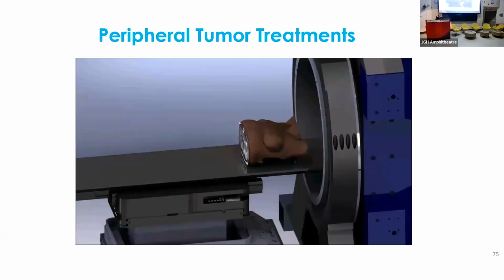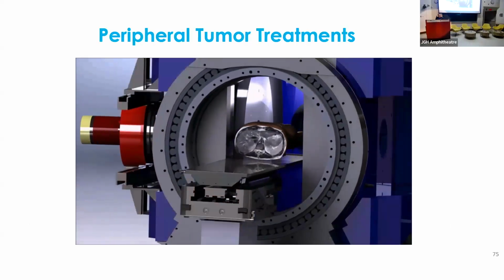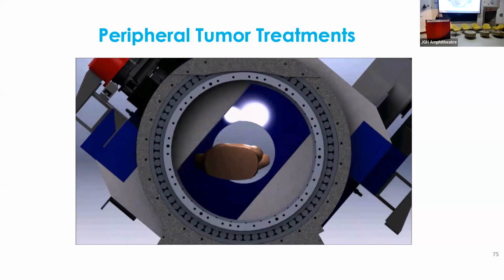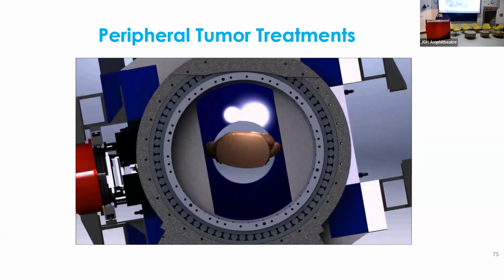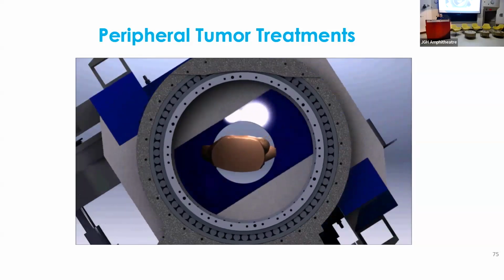So this is how we do it. By rotating the gantry and moving the couch, this is just a video. You notice in this case, the breast here is the target. So you notice I actually move the breast and put it at the center. And if I continue on, you could do the same thing on the other side. But you cannot do it if you have a cylindrical magnet. You can't do it. All right. So these are very practical problems, which took us a while to figure out.